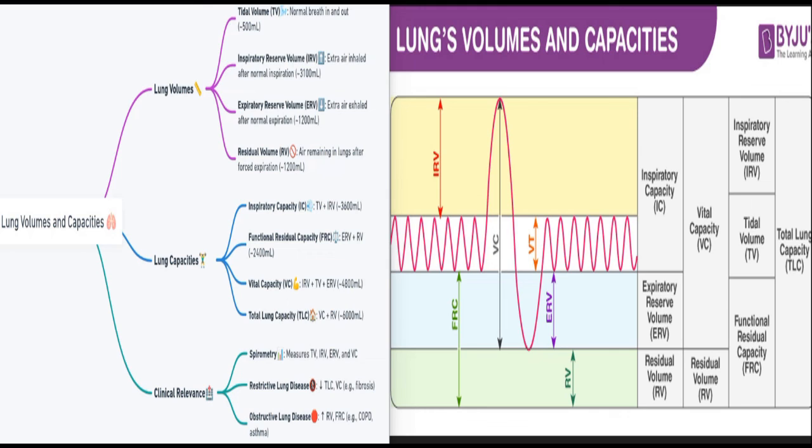You can think of conditions like interstitial lung disease, lung fibrosis, kyphoscoliosis. Mixed obstructive and restrictive pulmonary disorders exist when both the FVC and FEV1/FVC are reduced, and the features of both obstructive and restrictive patterns are present.